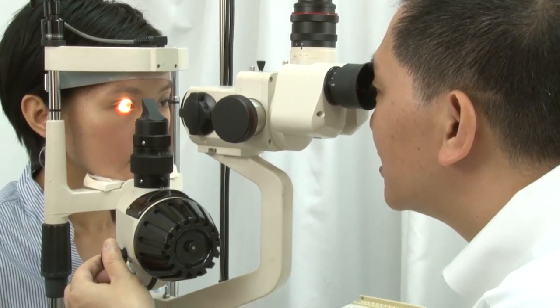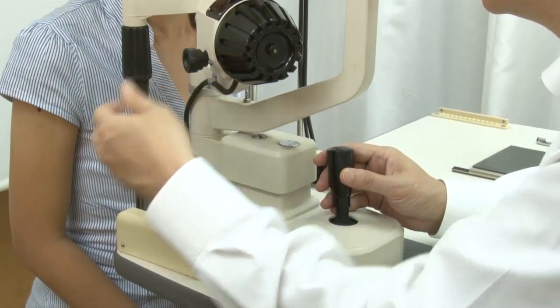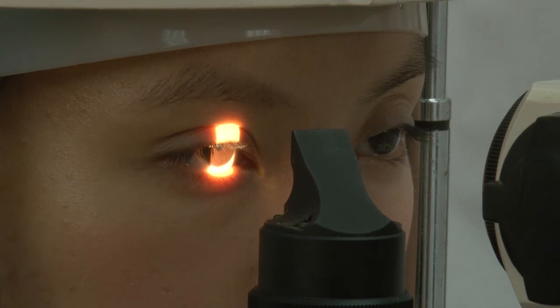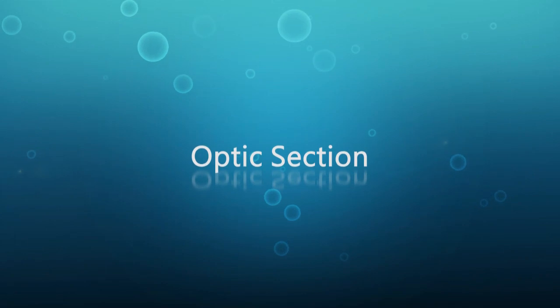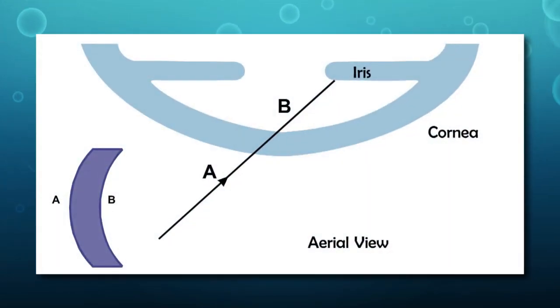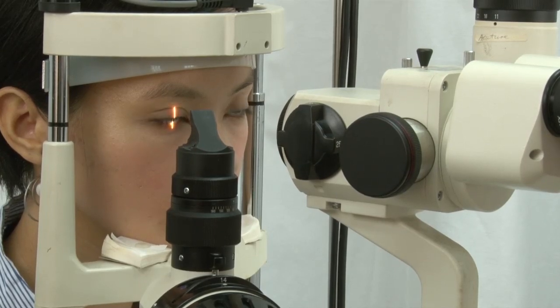To perform the parallelepiped technique, maintain the angle between light source and microscope at about 45 to 60 degrees. Change from diffuse illumination to a parallelepiped by narrowing the slit lamp beam to about one to two millimeters. Magnification generally begins from low to medium. An optic section can be created from a parallelepiped by narrowing the slit width to a thin slit. Magnification should be set at medium to high to provide the best view of the cornea.